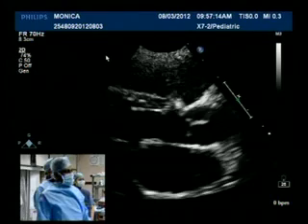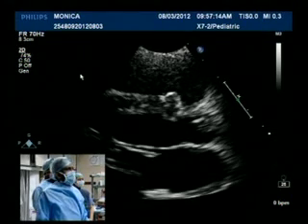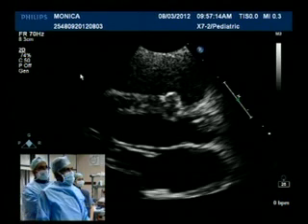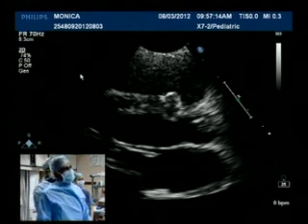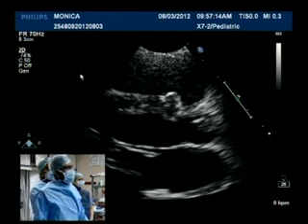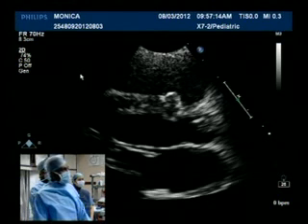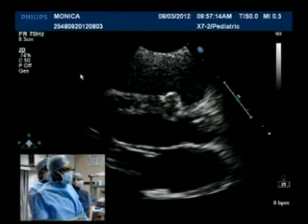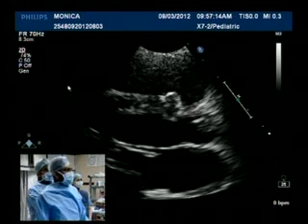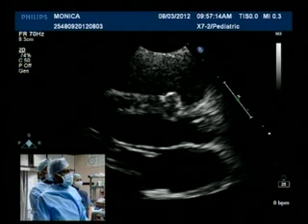I have another question to you, Nagesh. Are you going to change your decision based on angiographic views, or are you just going ahead with echocardiographic imaging only? Yeah, most of the times we take the decision based on the echocardiogram, but as you said, sometimes multiple defects are often missed by echocardiogram because of the color jets which cause confusion, and different planes we may not be able to profile in the same view.